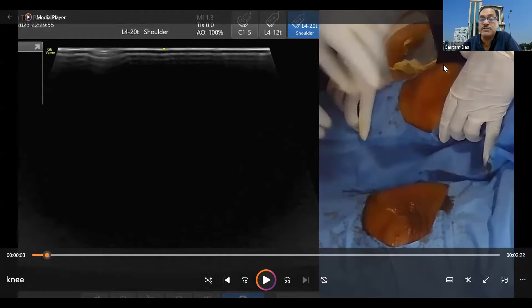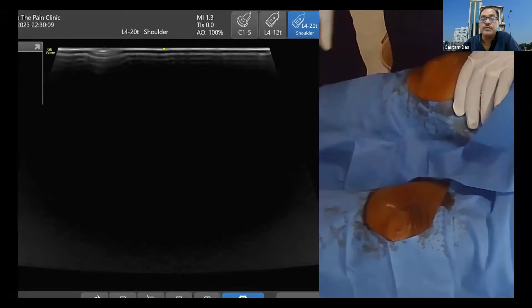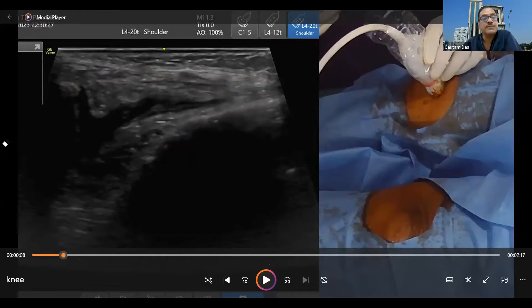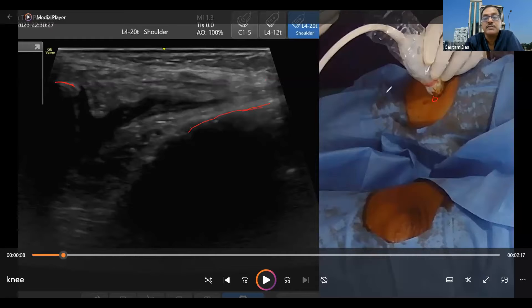More importantly, you can see the patella facing the lateral side. External rotation is important so that the medial part — the medial condyle and the patella — is exposed nicely. The aspect marker is towards the lateral side, and we are holding with the aspect marker on the other side, which is on the lateral side. This side is the medial side.